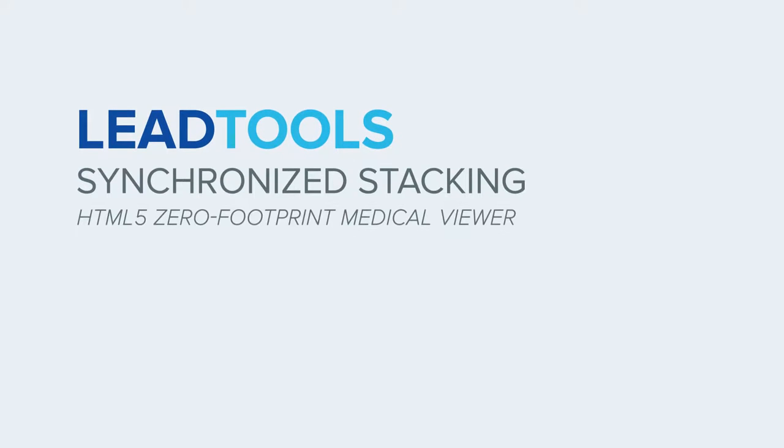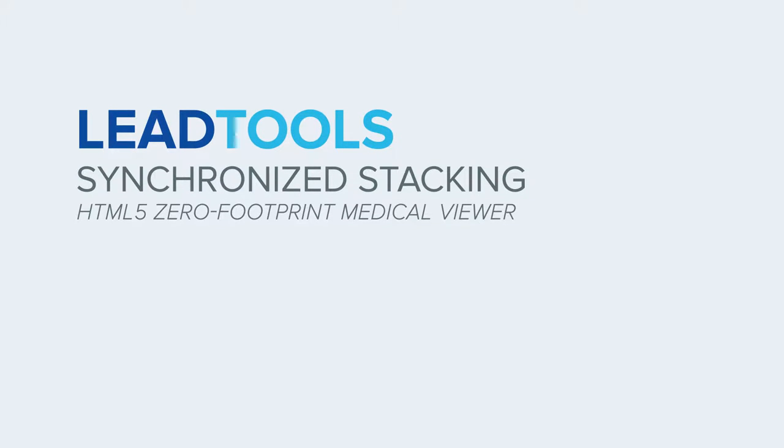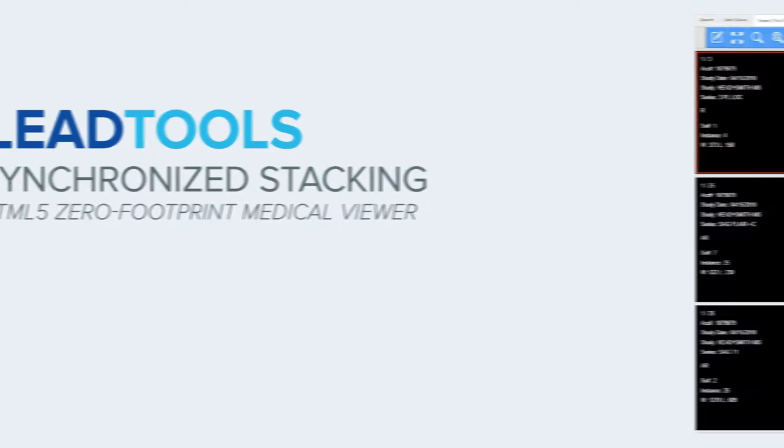In this video, we will demonstrate the series synchronization feature found in the LeadTools HTML5 Zero Footprint Medical Viewer.